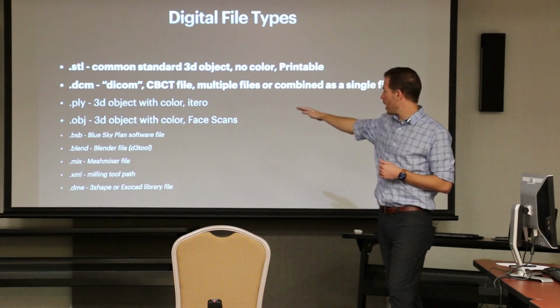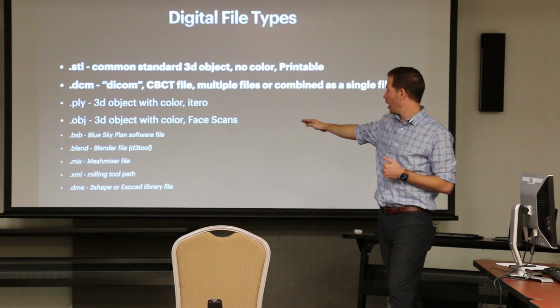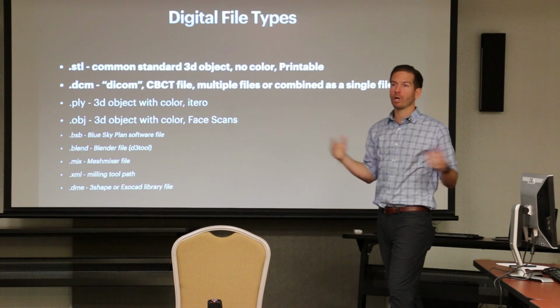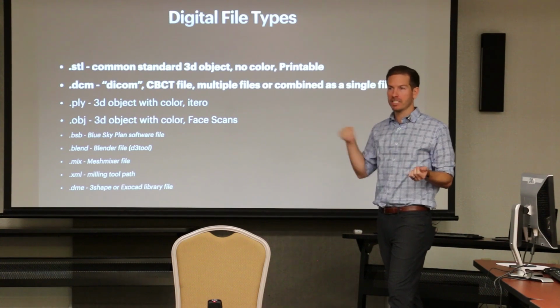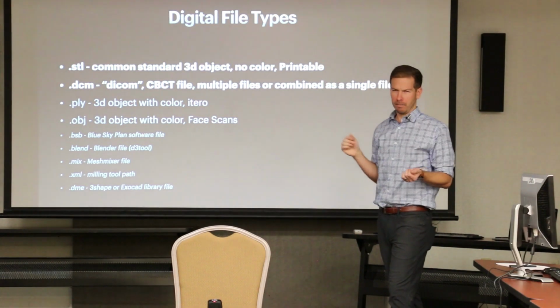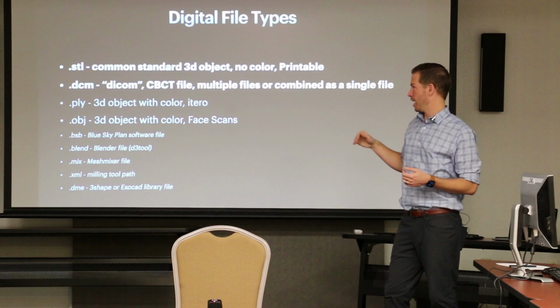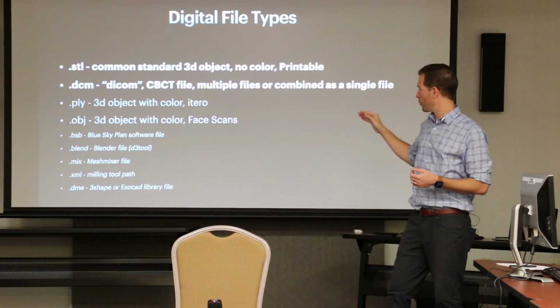And then the last five down in here are specific software files. Like when you save a Word document, it's .doc, and then some Excel file, XLS. Those are specific to that software.